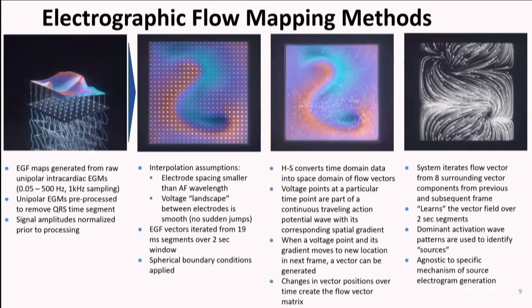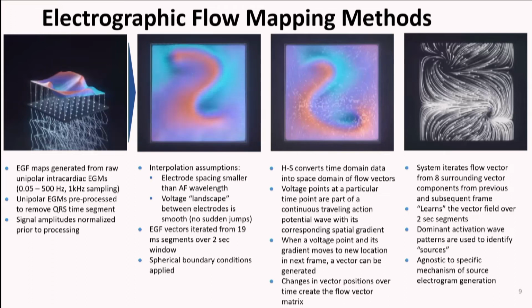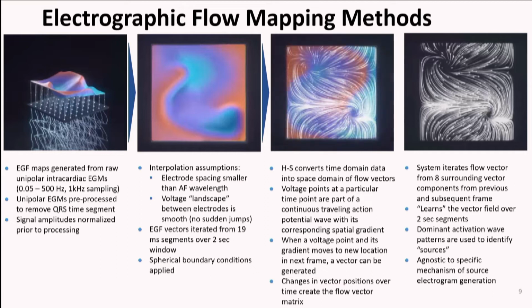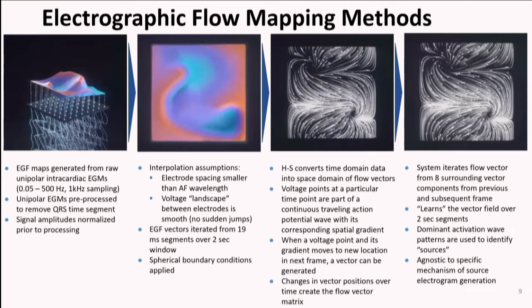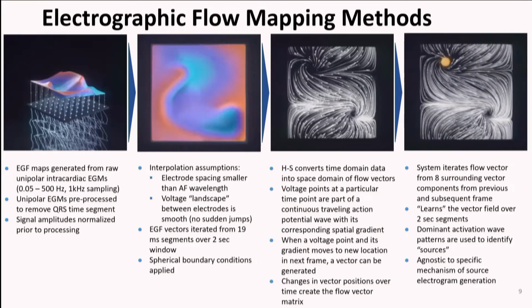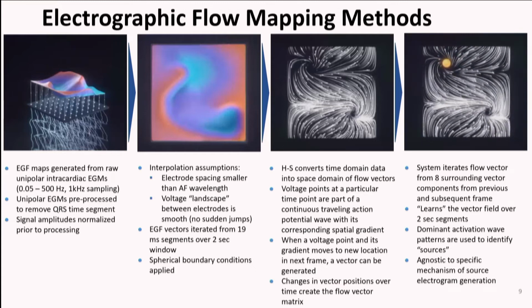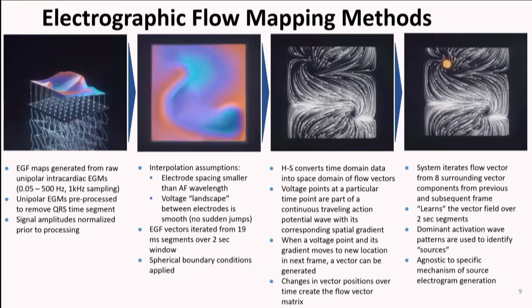And then over the 2-second windows, spherical boundary conditions are put in, because obviously this isn't just a sheet, it's a basket. Then this algorithm, the Horn-Schunck algorithm, converts this time domain data into the space domain, and what you're seeing there is a single 2-second representation of the flow vectors. And then you take all these 2-second vectors, you put them on top of each other, and you have a statistical understanding of where the hotspots are.